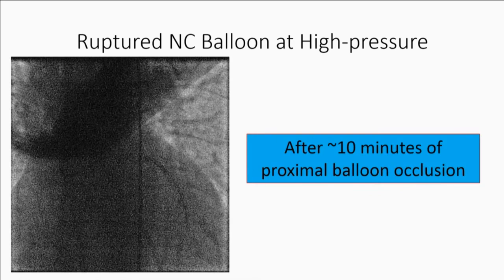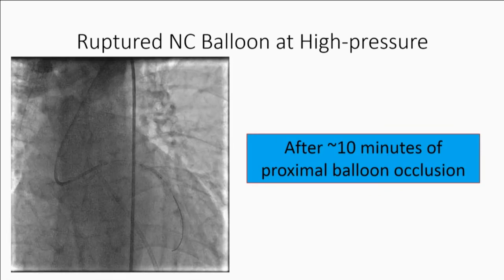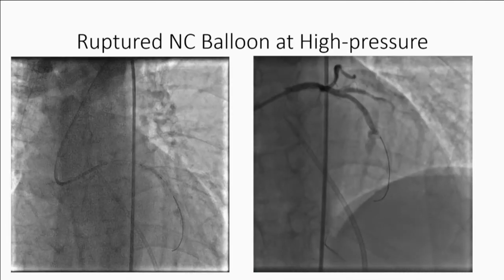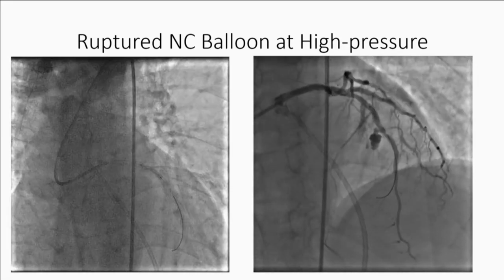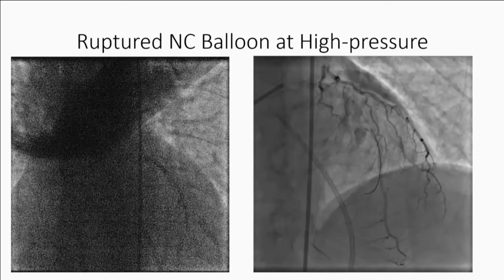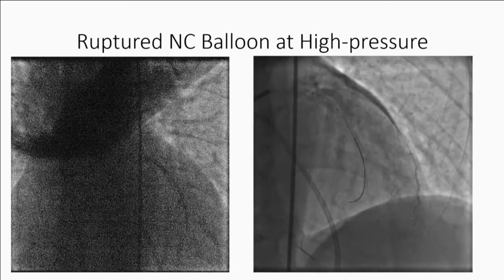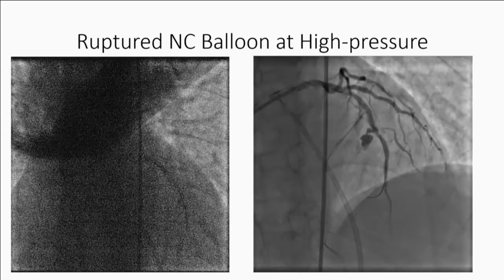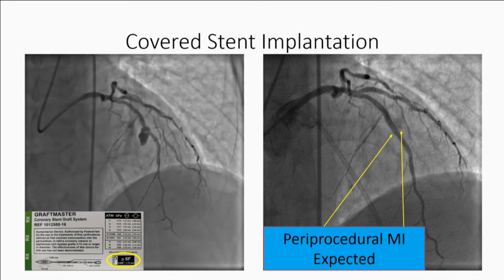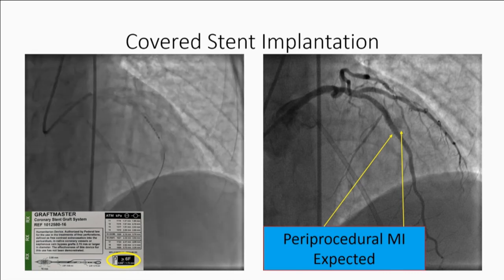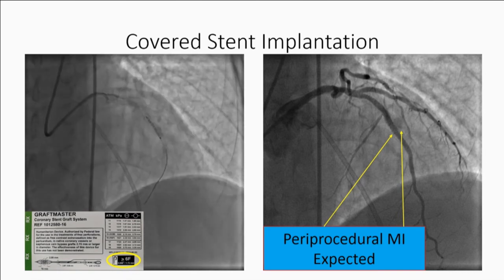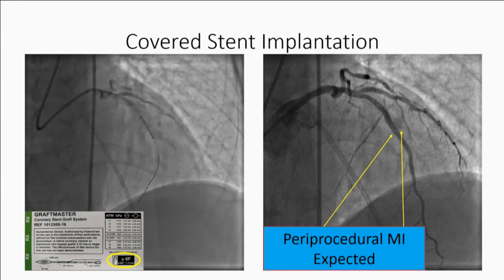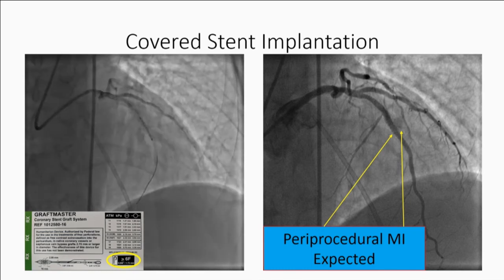We also auto-transfused this patient. After about 10 minutes of proximal balloon occlusion — which is how my partner handles these — you can see on this angiogram that the perforation was actually much larger and more wide open initially, but this is after 10 minutes of balloon occlusion. The ACT at this point was about 230 with no extra antithrombotics given. The decision was made to implant a covered stent. The GraftMaster can be delivered via 6 French guide, so you don't need to upsize. However, a large septal and a large diagonal were lost, leading to periprocedural MI. The patient did well outside of that.